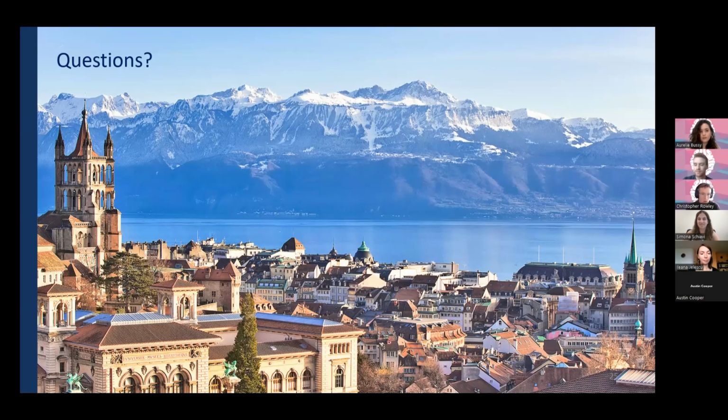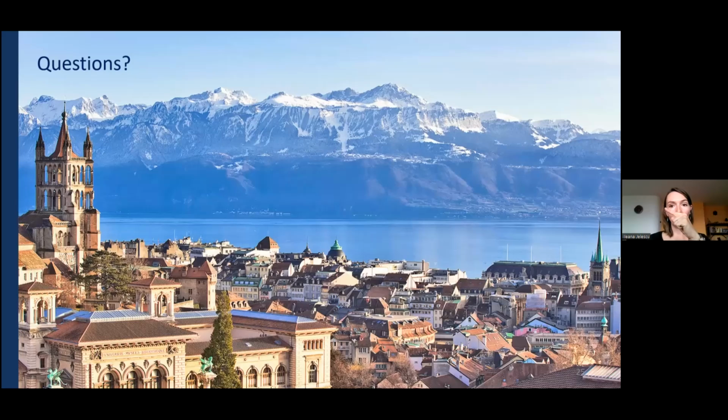Oh, really sorry. Yeah, probably I should have had a slide about that, but I'll be hand waving. I hope everyone can see me. So typically when we encode for diffusion, we impart diffusion sensitization in one specific direction of space, right? So if you play the typical PGSE pulse sequence where you have a first gradient lobe, you let it diffuse, and then you refocus with the second gradient lobe. This is what you will do, right? The resultant of your gradient in space will give you the direction in which you're imparting diffusion sensitization.